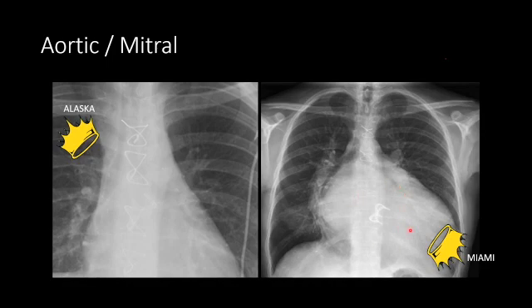A mitral valve is pointing down towards Miami, while the prongs of an aortic valve are pointing up towards Alaska. So this is an aortic valve replacement, and this one is a mitral valve replacement.